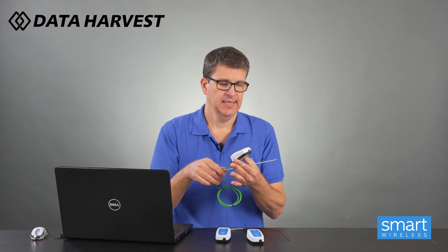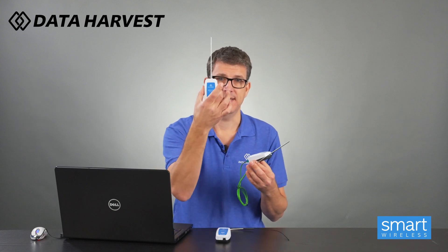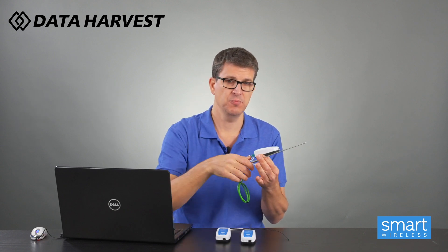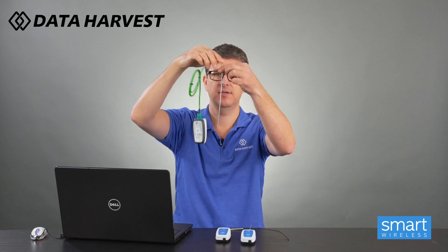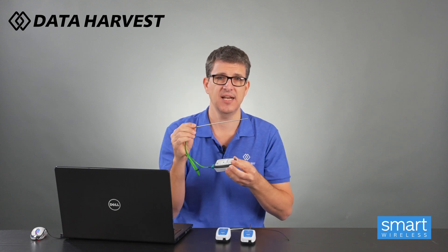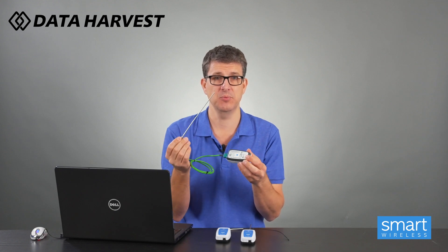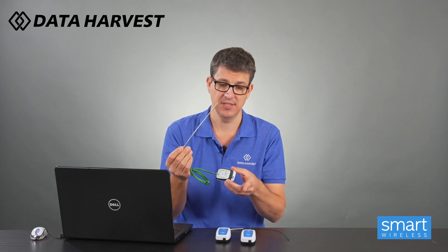The K-type thermocouple will also work for all the experiments that the housed one does. You can only insert it up to where my finger and thumb is - it will work in solutions. But because it's minus 200 to 1000 degrees, you can put it in with the Bunsen burner to prove yellow or blue flame which is the hottest. That is the ideal experiment for that - the other two will not work, but this can be used the same as the housed one as well.